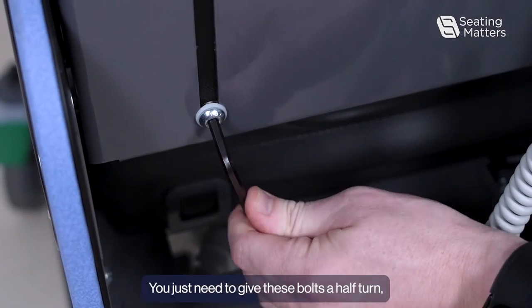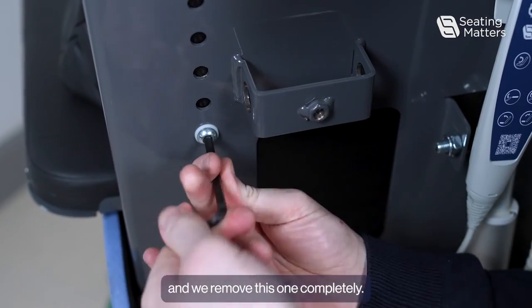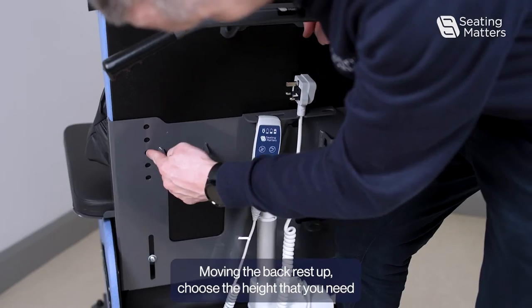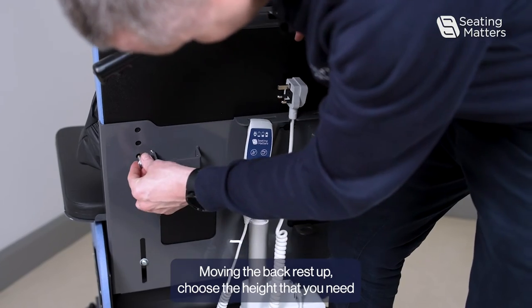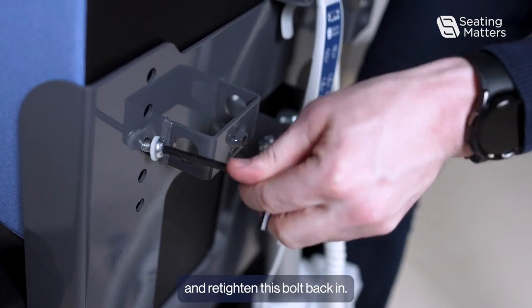We just need to get these bolts fastened and remove this one completely. Moving the backrest up, choose the height that you need and re-tighten this bolt back in.